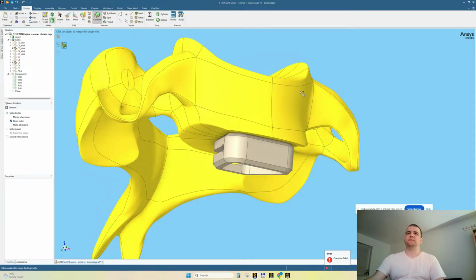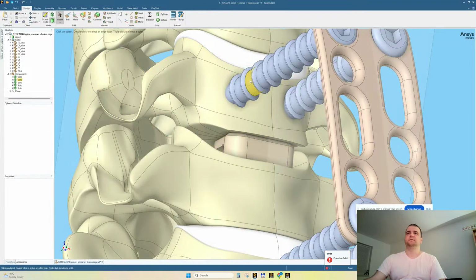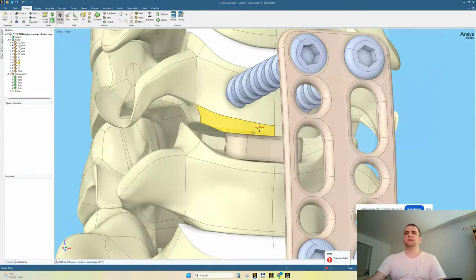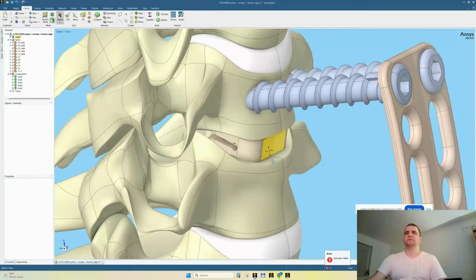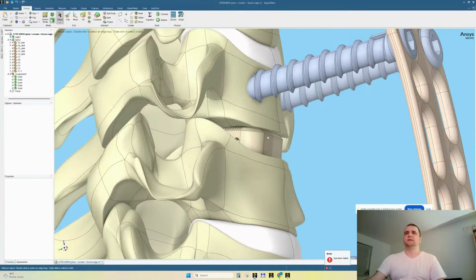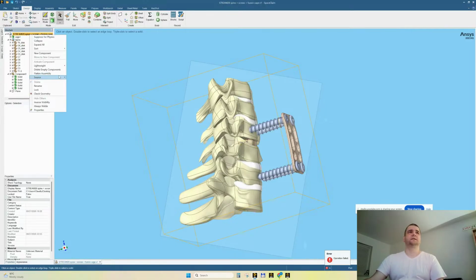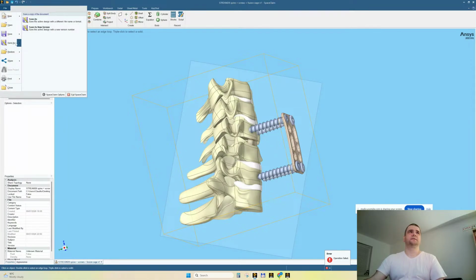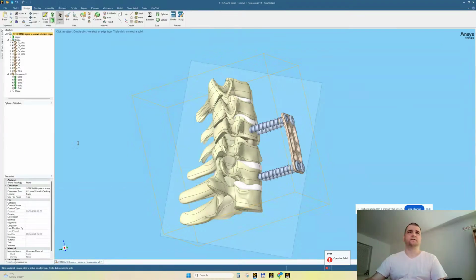But I have now complete visibility here, escape. And yeah, it looks more professional, let's say. We can also kind of cut here, but I don't want them overkill. Let's leave it like this, all right? Because we do have something nice, let's create right-click source internalize all. Let's create another version. Once in a while, we need to create another version.